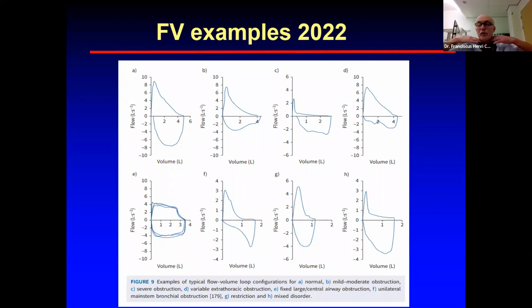And that could be vocal cord dysfunction, and I even saw clinicians missing the correct decision since they didn't look at the flow volume curve. And going back to the question in detail, I always look if at the end we have something which is going, like in example A, quite good down to 0, or like example H, that at the end you can see that it goes directly straight down.